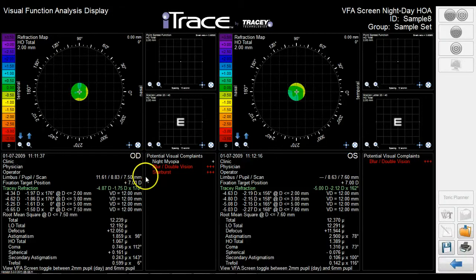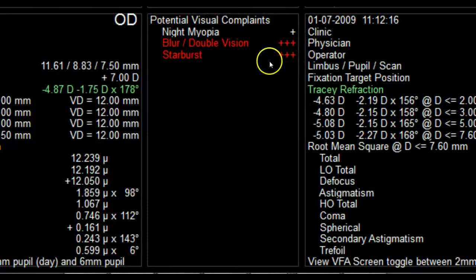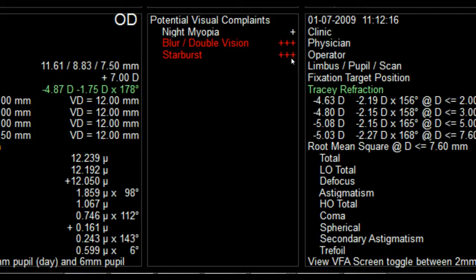As you can see, the iTrace VFA screen is very valuable in your dialogue with patients. This last panel provides you with suggested complaints that the patient may experience due to the aberrations present in their vision. The potential visual complaints are color coded and include 1 to 3 plus signs to signify the extent of the complaint. It is highly likely that this patient experiences significant blur and double vision due to the coma, and star bursting from trefoil aberrations, along with some night myopia due to the change in refraction from a photopic to a scotopic pupil.